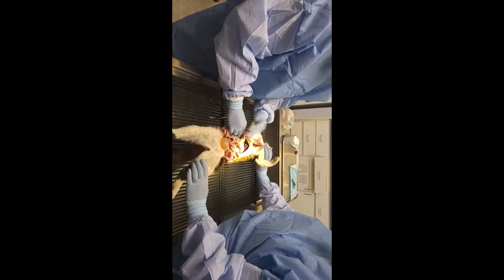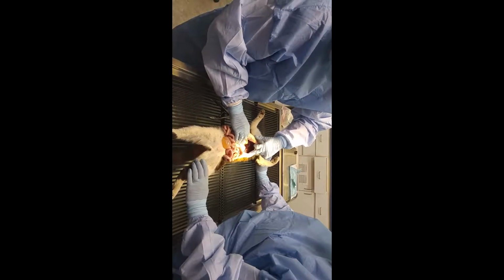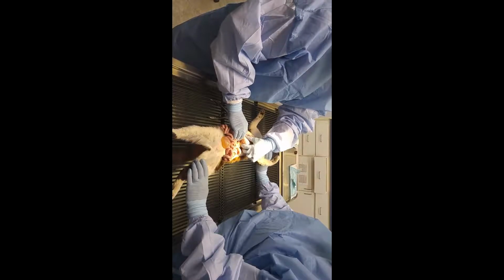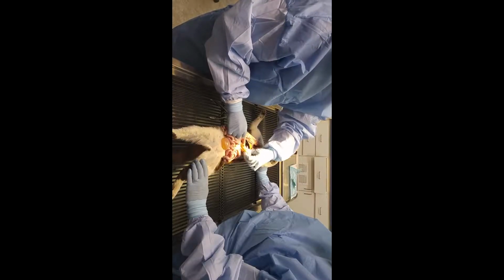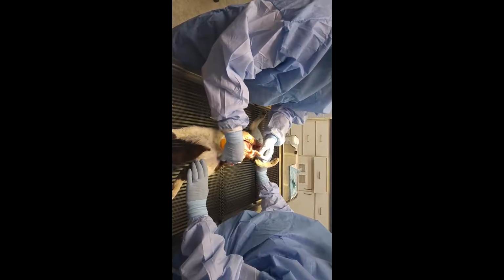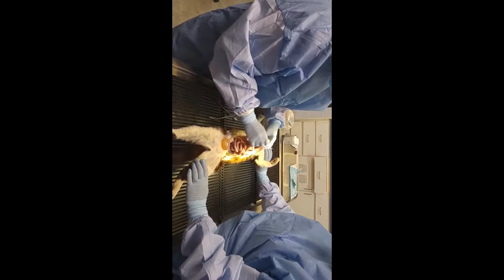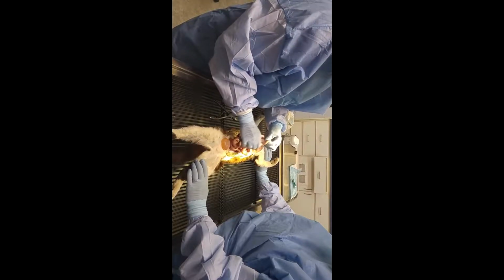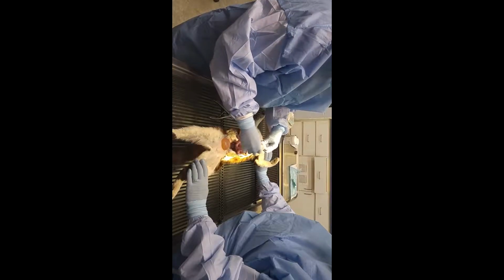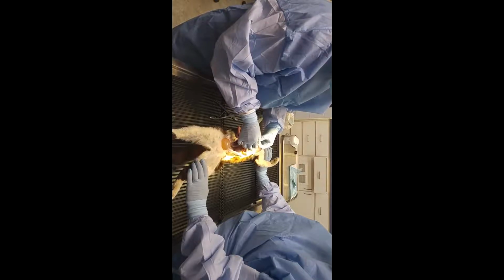If this were an animal that the owner suspected some type of poisoning or toxin ingestion, we would definitely look at the liver. We'd probably open the stomach and check the contents. And then from that point, we just basically run the bowel and go the whole length of the bowel, looking for abnormalities along the way. The entire intestinal tract feels very thickened to me. This patient has been deceased for a few hours, so this may be a postmortem finding.